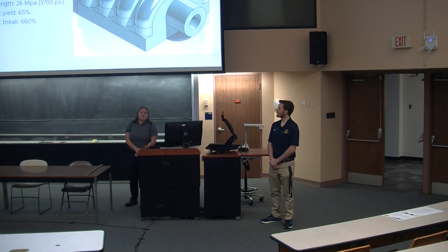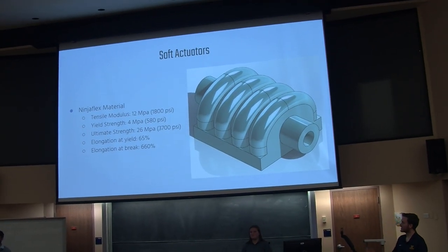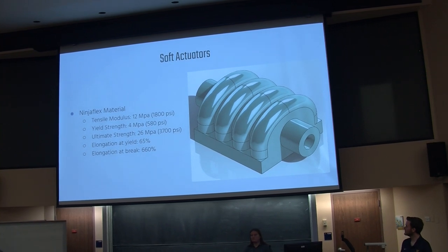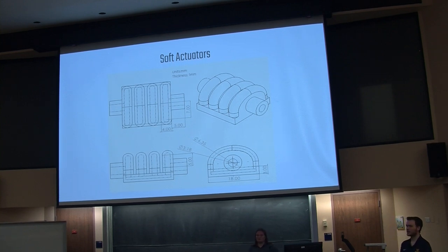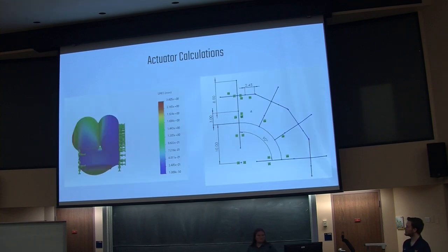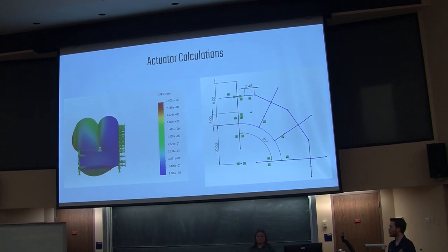These are the designs of the soft actuators. We used a Ninja Flex material created through 3D printing. These are the mechanical properties of the material, and these are the schematics of the product. The numbers represented here are constants kept throughout each actuation design. For each actuator, they lie down on each knuckle, so each of them have to create a specific bending point. Gaps between the ribs as well as height differences create different bending points. The image on the left is the simulation with about 10 pounds of pressure, just to show the behavior and how the actuator should work.